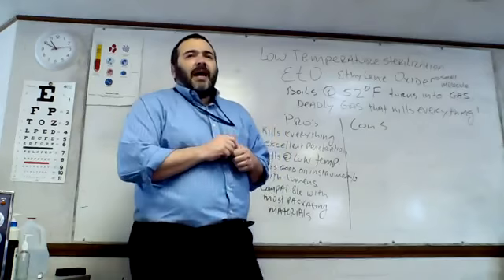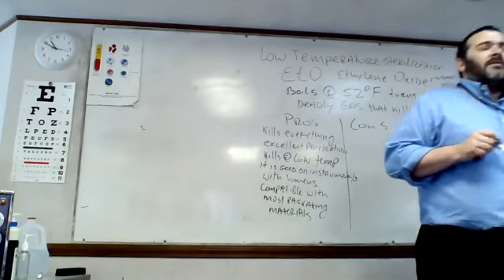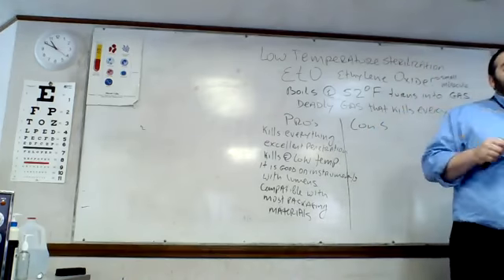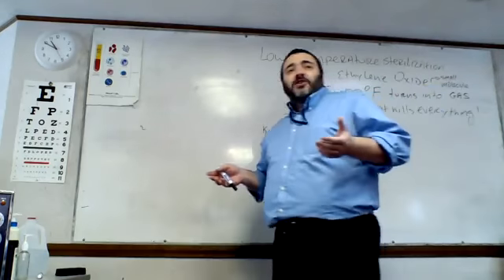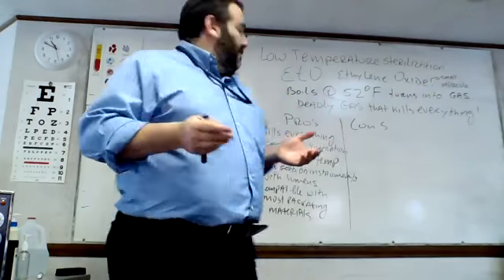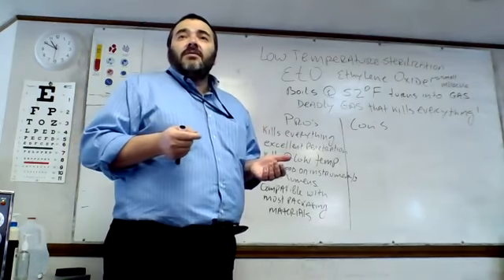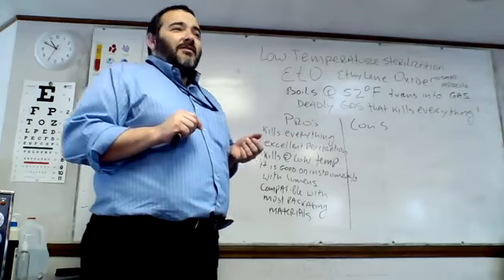Compatible with most packaging materials. All right, we get into everything. We kill everything. We do it at low temperature. We're compatible with most packaging materials. Did I miss anything? I don't think so. These are the pros. Let's talk about the cons.